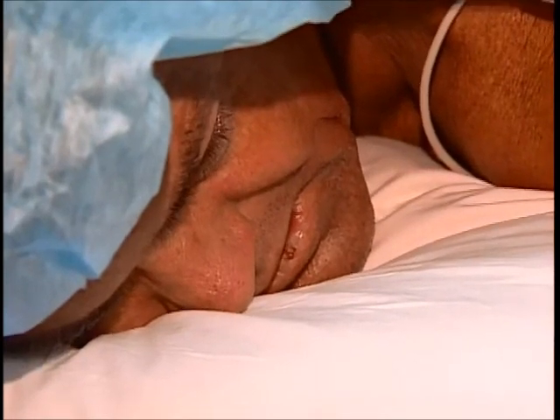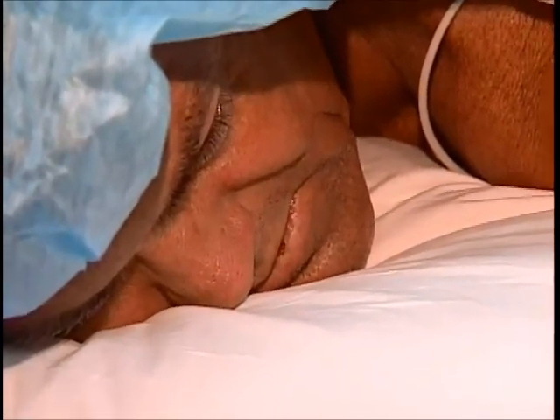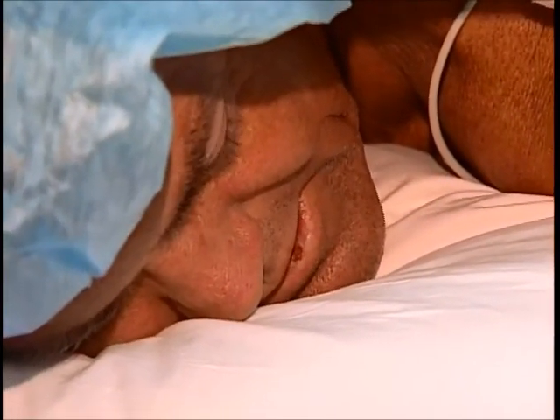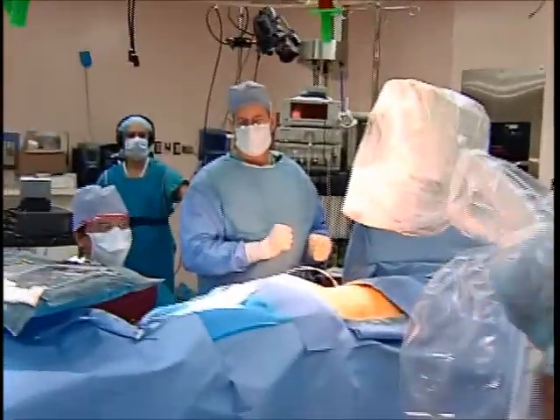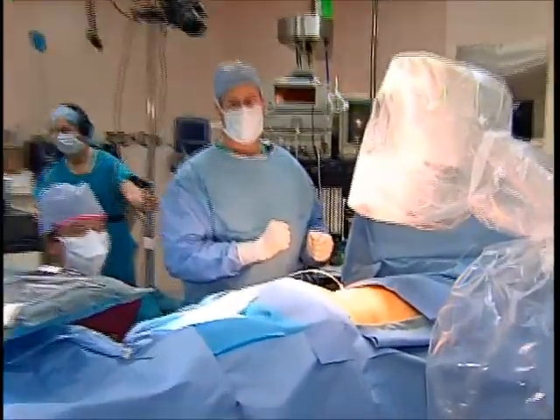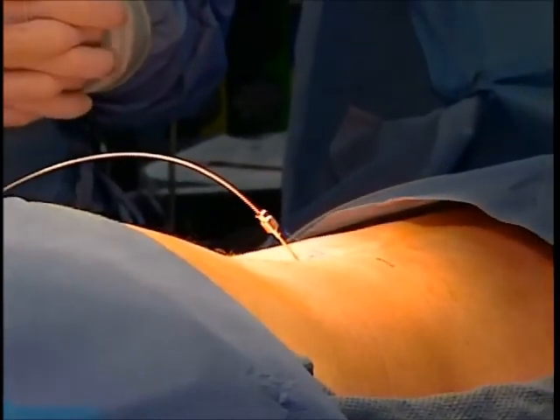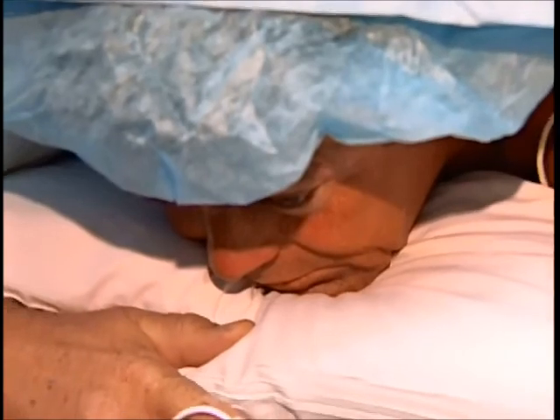Anything there, Bill? I feel tingling. Where? In my upper leg, the hip area. With the electrodes properly positioned, Bill's nervous system comes alive with activity. Wow, look at that. All of them. Okay, that's exactly what we want. Now we're going to withdraw. Sensations flood muscles and nerves, and Bill is on his way to making medical history.